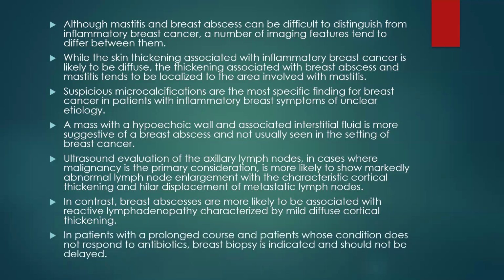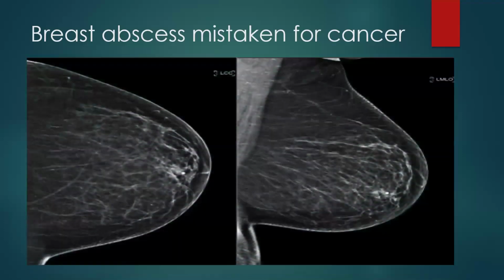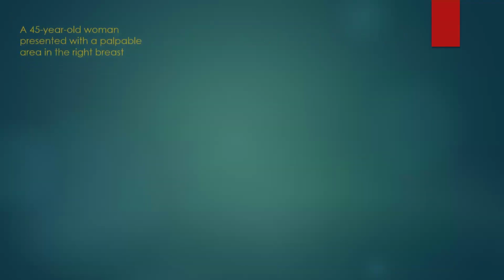In patients with a prolonged course and patients whose condition does not respond to antibiotics, breast biopsy is indicated and should not be delayed. This is a mammographic image of a breast abscess that was mistaken for breast cancer, and biopsy revealed that it was a breast abscess.